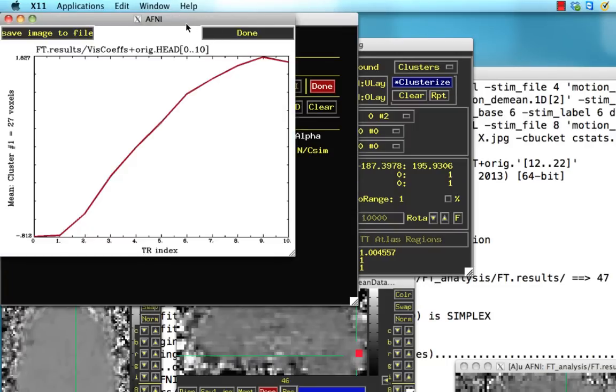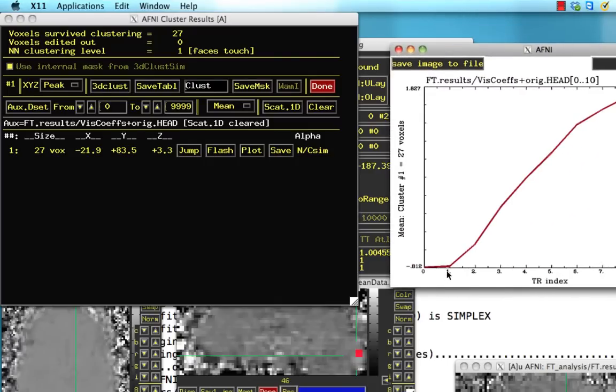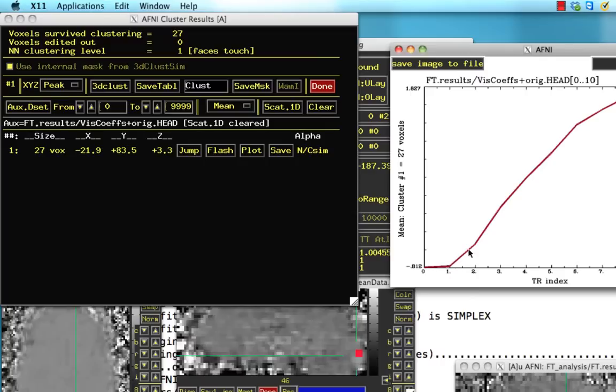Click on plot, and now I have plotted right here everything in those different time points. So there are 11 total going from 0 to 10. If you include 0, that's 11, and at each one it's giving you an estimate of how much activity there was, averaged across this ROI for that specific condition.